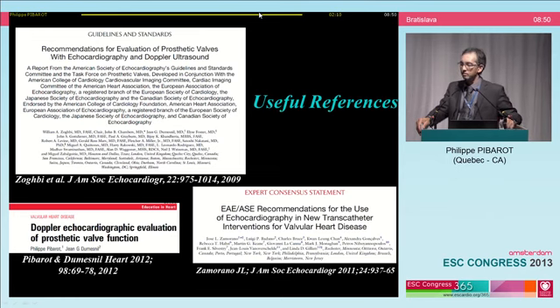I completely agree with you, Philippe, that the most important thing for the surgeon at the time of the surgery is to implant the right size valve in terms of the orifice area of the implanted prosthesis. The only thing which is not necessarily covered is, and you're absolutely right, it's never possible to achieve a bigger orifice area than the prosthesis has by calculation or by how it is manufactured. But depending on how it is implanted from the surgical point of view, you easily can obstruct the prosthesis already during the time of surgery and cause early PPM based on the surgical problem during the implantation.